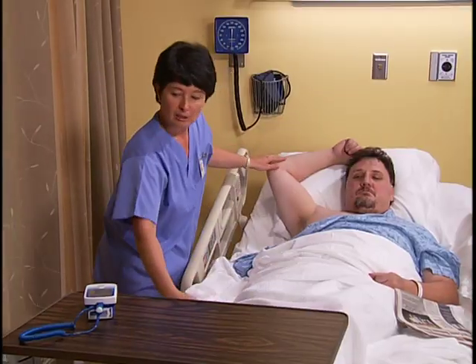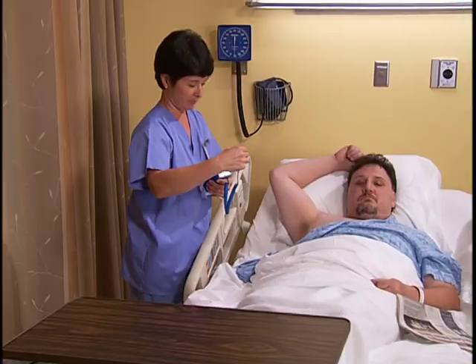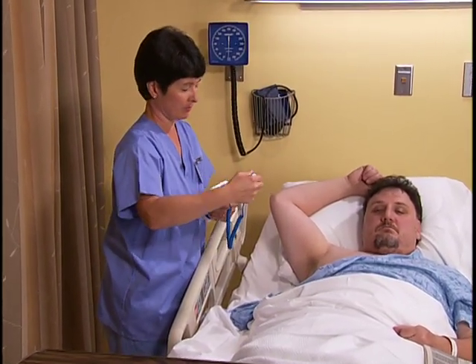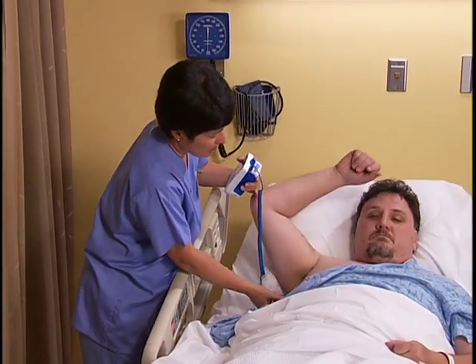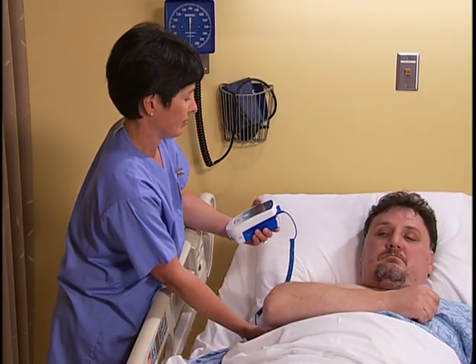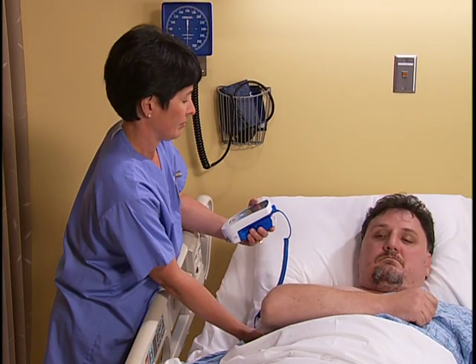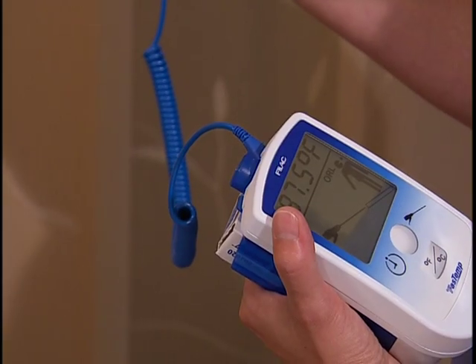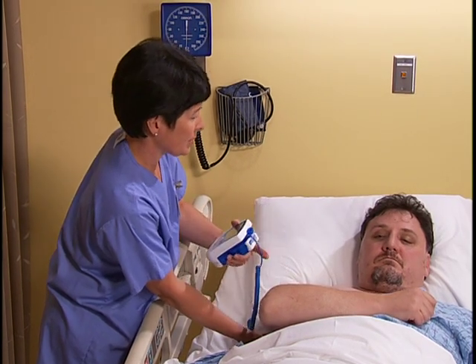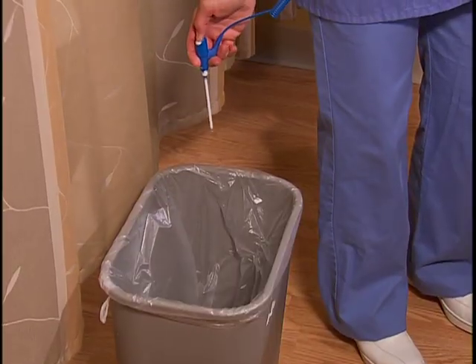Raise the patient's arm away from his torso and inspect his axillary area for lesions or heavy perspiration. If needed, dry the area. Holding the top of the blue tip oral probe, slide a disposable cover over it. Then insert the probe into the center of his axilla and move his arm over the probe and across his chest. Hold the probe in place, listen for the completion signal, and look for the digital display of the patient's temperature. Then remove the probe, tell the patient his temperature — your temperature is normal — discard the probe cover properly, and put away the thermometer and stem.